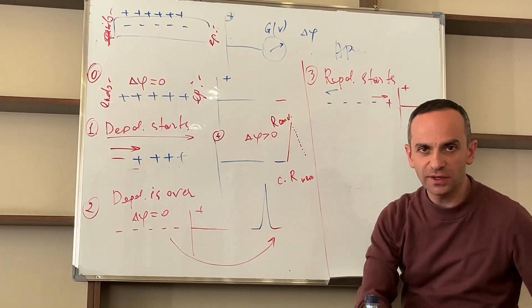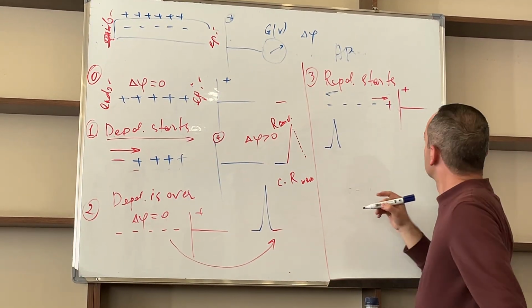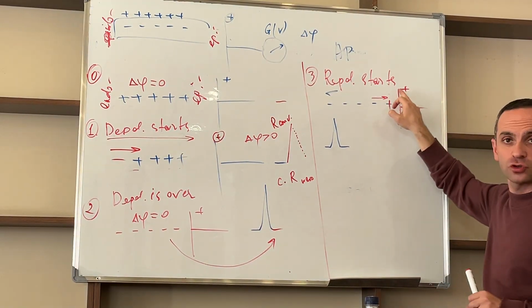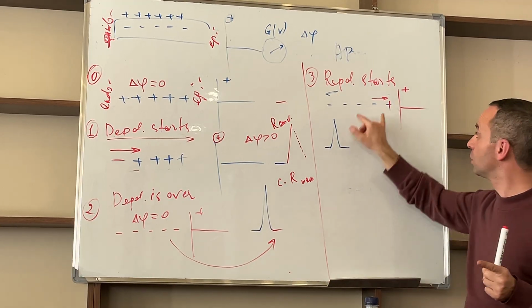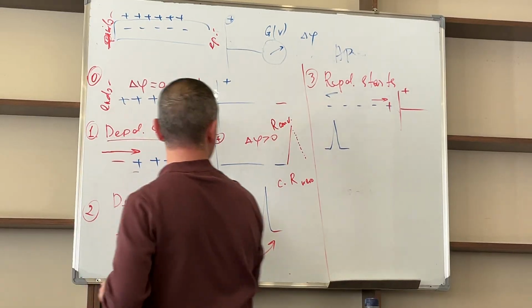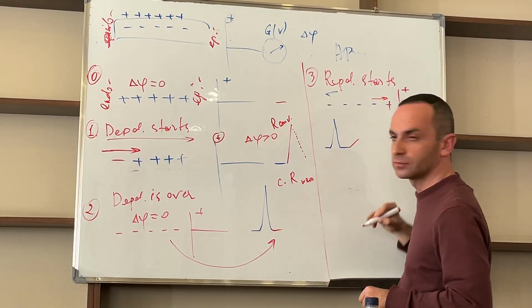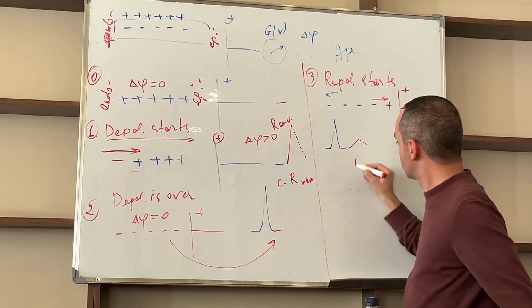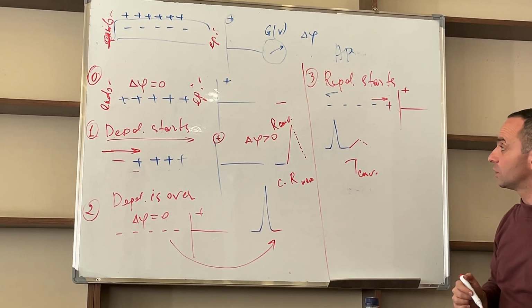Now let's see what we may have here. We had this, and this. It should be again a positive deflection. The third rule states that the repolarization vector is smaller and slower than depolarization. So we'll have a conventional T like this. Smaller and slower.